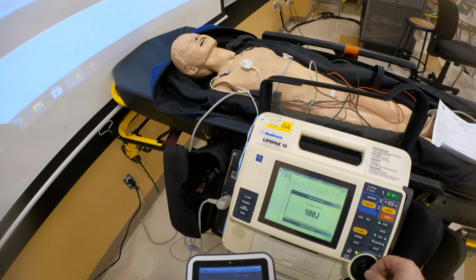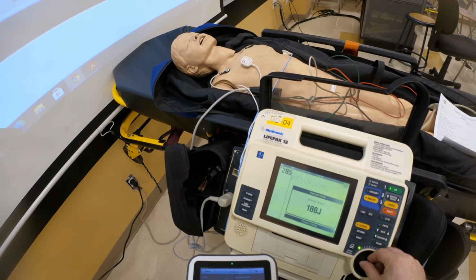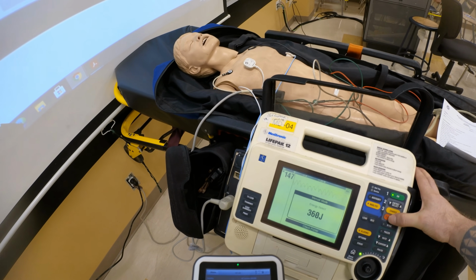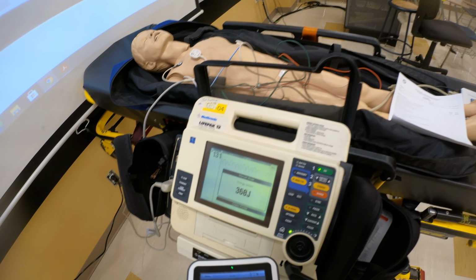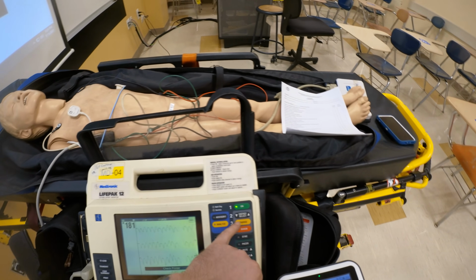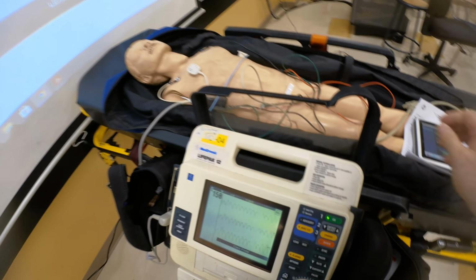I also seen this same thing occurring if they wanted to defibrillate. They'll put 360, right? They'll say, everyone's clear, and then they'll press the shock button, did not charge it. So this is another common mistake the students make. So failure to place the limb leads, failure to charge, and then the other thing, why this is important, I see them improperly placing the limb leads.